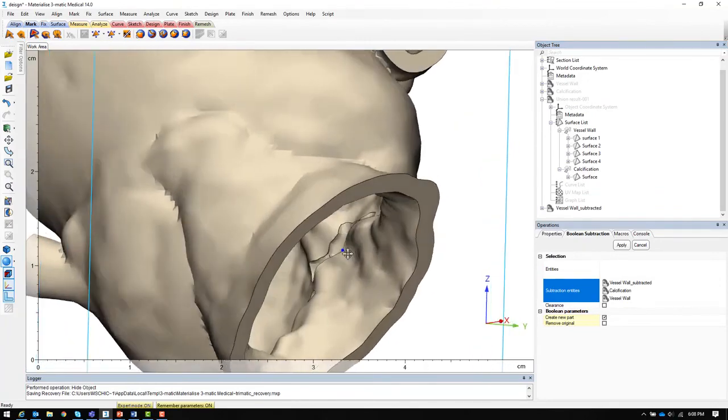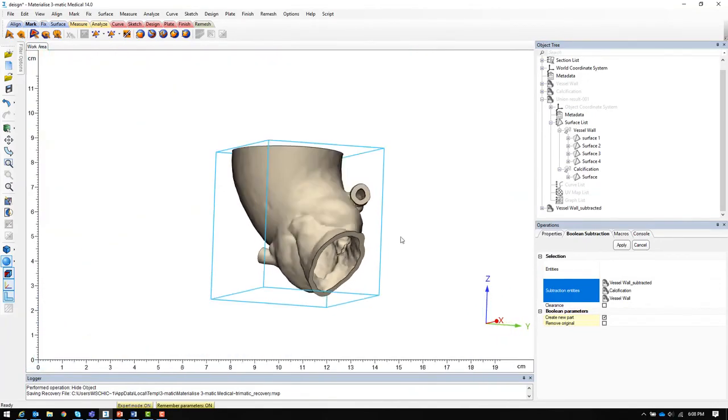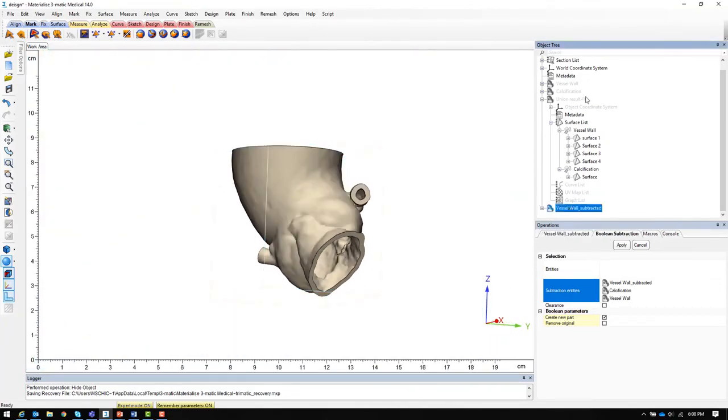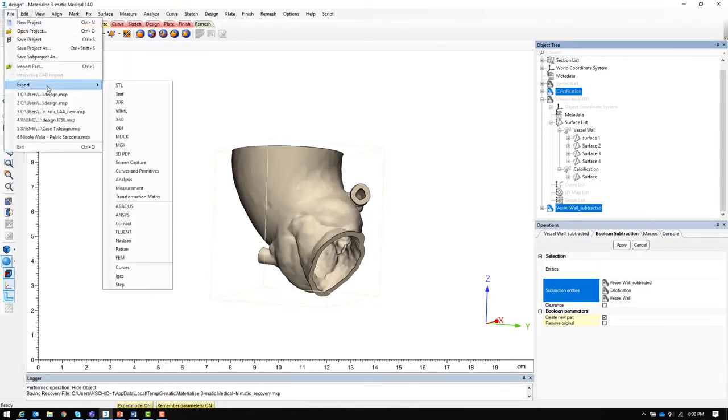Once we have ensured that there are no intersections, the final models including the vessel wall subtracted and calcification can be exported as STL files and taken to a build processor.